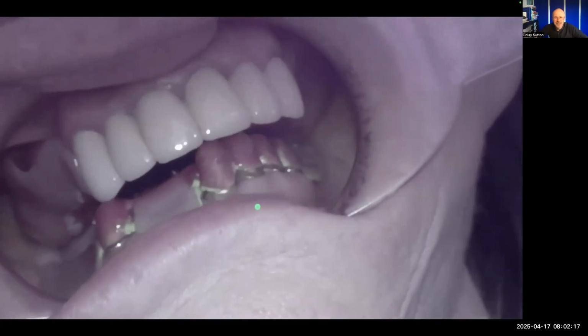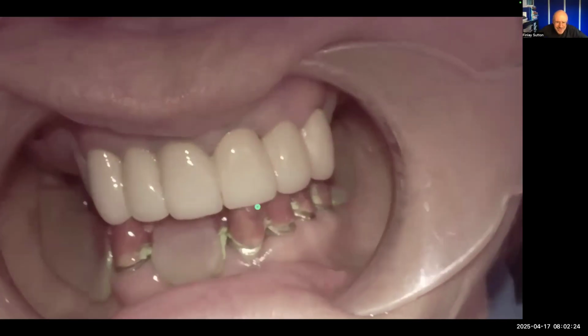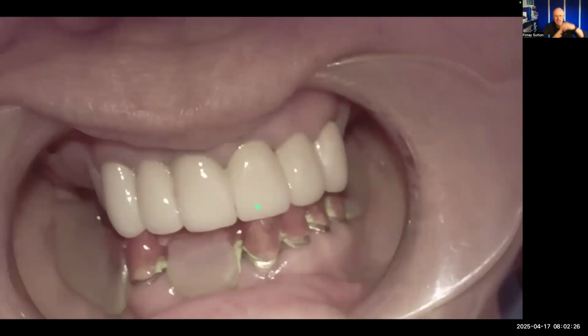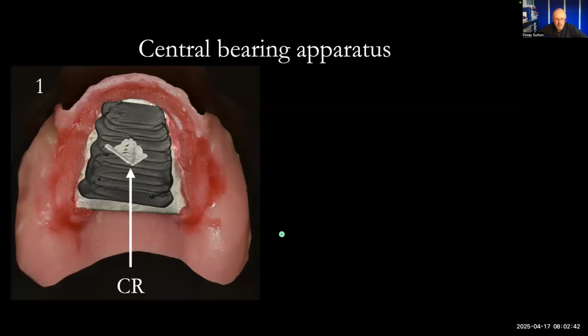What's really important in these cases as well is that we're not interfering and touching the teeth. I just want the stylus to be touching without these copings hitting those teeth. So sometimes I've got to open the screw up a little bit on that just to allow that to happen. And so she moves around and she produces a lovely, beautiful arrow, absolutely bang on where CR is, super accurate.